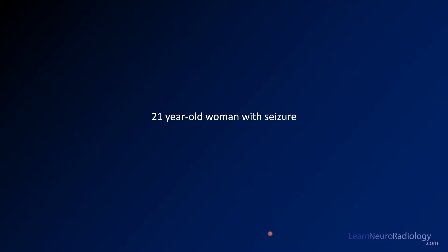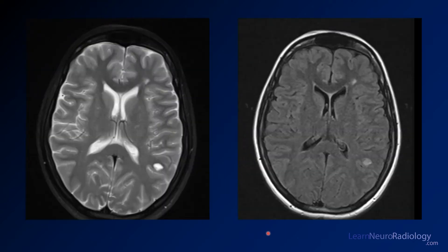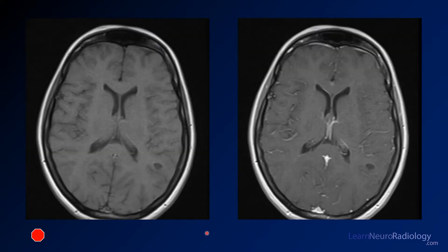Here we have a 21-year-old woman with a seizure. On T2 and FLAIR, there is a small cystic cortical or subcortical mass in the left cerebral hemisphere, about a centimeter or less, very well-defined. It doesn't suppress on FLAIR. On pre-contrast imaging there's not much going on, and on post-contrast there is little if any enhancement.